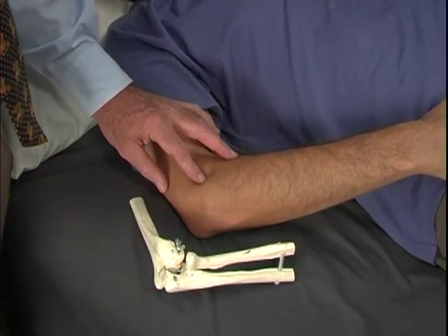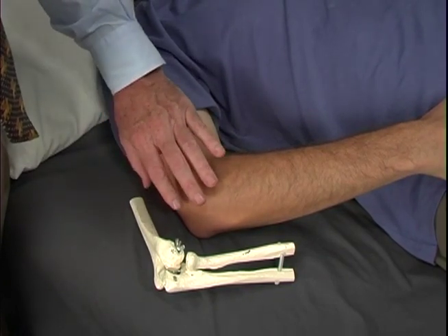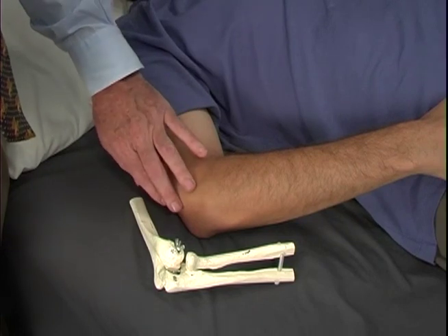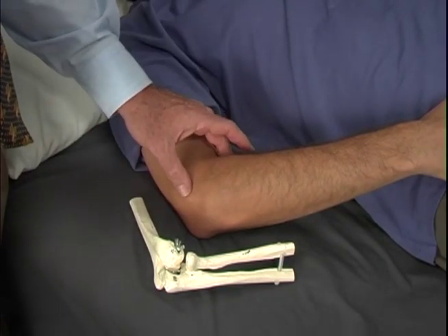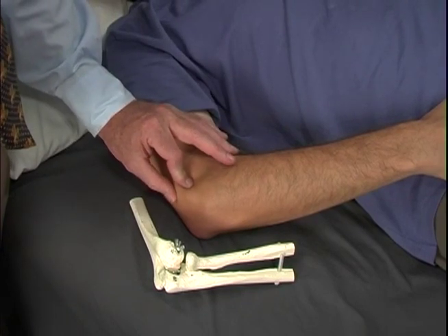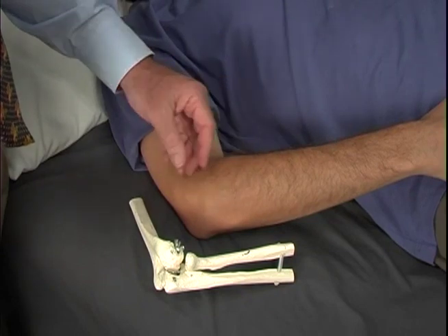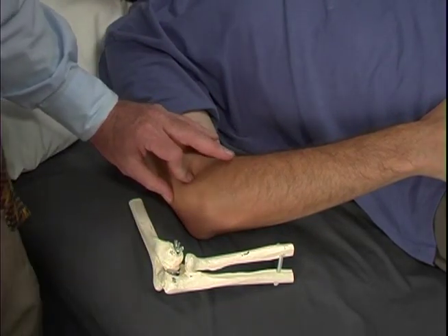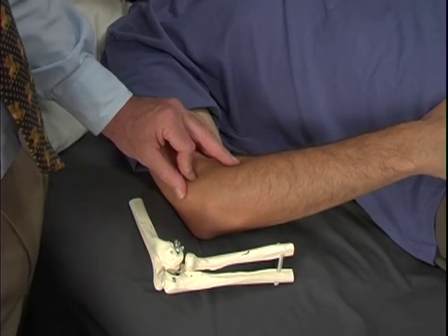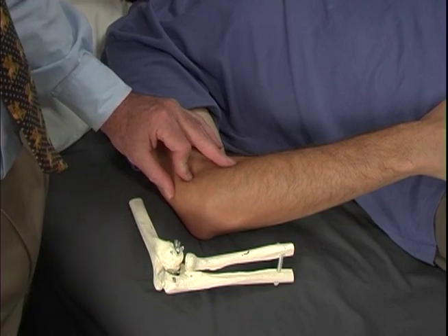Now we'll be demonstrating the injections of the elbow. We're basically concerned about the lateral epicondyle area and the medial epicondyle area. The lateral epicondyle contributes to lateral epicondylosis through the attachments of the common extensor tendons of the forearm. This is a common condition that we find responds quite well to prolotherapy injections.